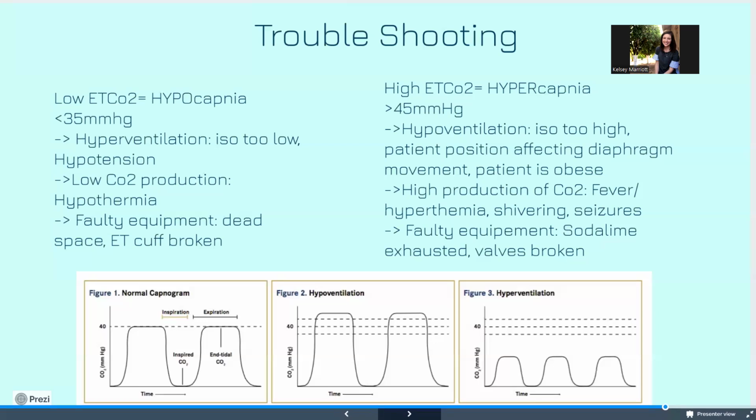So typically our first go-to is, how's our gas on our patient? Can we turn them down? Can we turn them up? How's our blood pressure? Because if our blood pressure is really low, we don't want to keep turning our patient up on anesthesia.